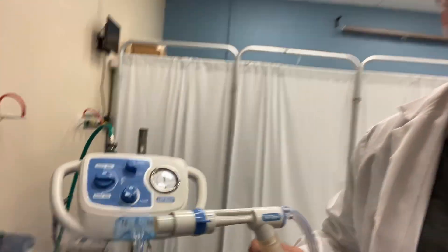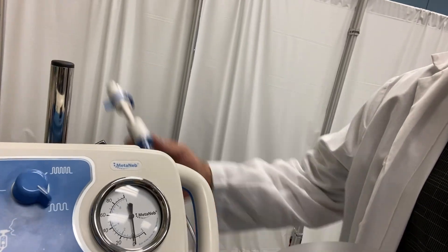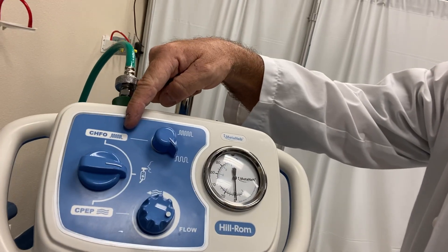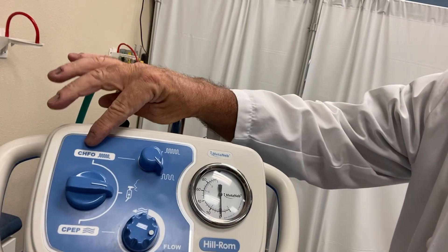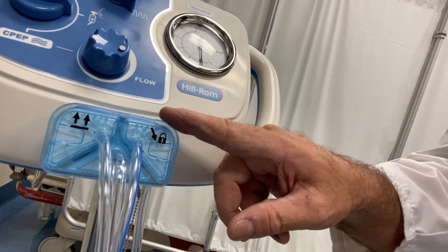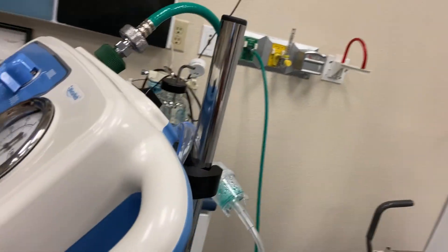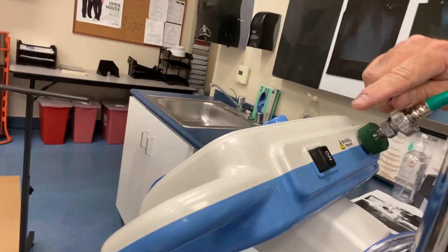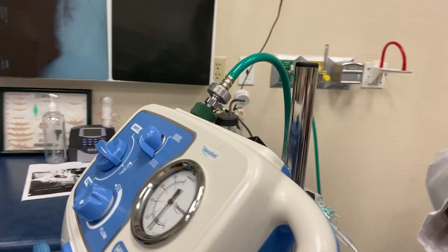Here are close-up views of the controls of the Medinab. You can see the different high-frequency settings, the high-low settings, and the toggle switch between small volume neb, oscillatory, and regular continuous expiratory pressure. There are the connections for the circuit as described earlier. Coming to the back of the Medinab, we have the on-off switch as well as the connection for your source gas. You don't necessarily have to use air — you can use oxygen or air, whichever the practitioner feels is most appropriate.